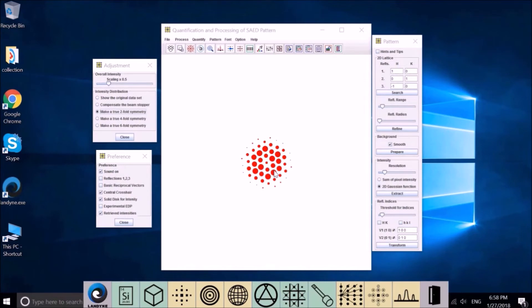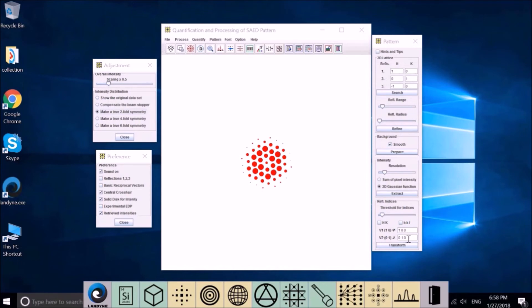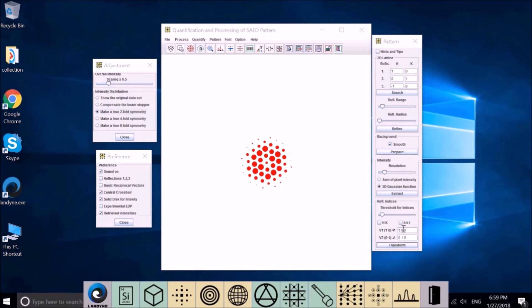To retrieve the intensity, we use the two-dimensional index system. Let's just use two short vectors in this pattern. The true index should be converted using the relation here. You can define the 1,0 as a true index here, and 0,1 as a true index here. Then you do the transformation.